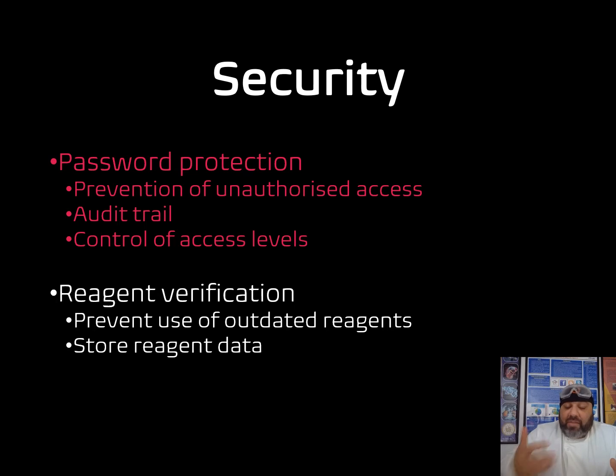So, for example, if there are senior health professionals at particular grades of scientific practice, then health professionals or laboratory scientists at lower grades would not necessarily require the same level of access to certain interfaces through pathology automation. And so pathology automation, in line with particular investigations, has prompted the control of access. There's a control of access levels.